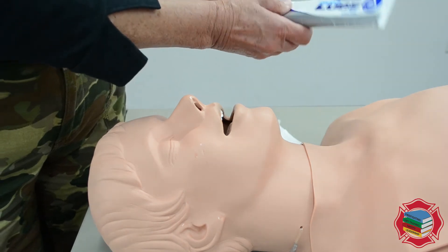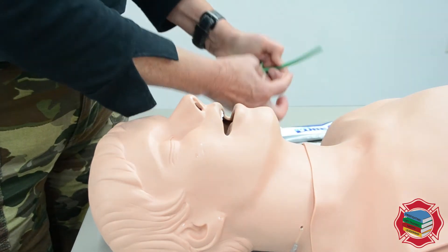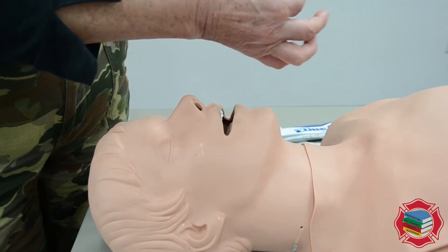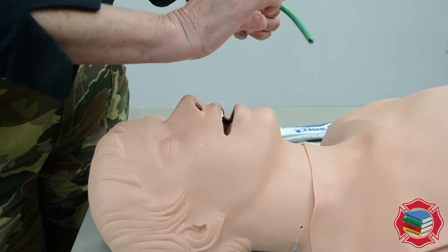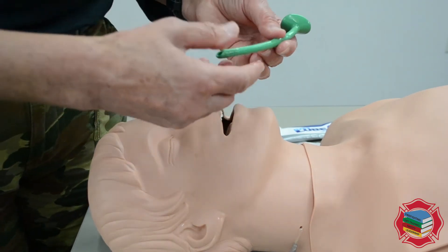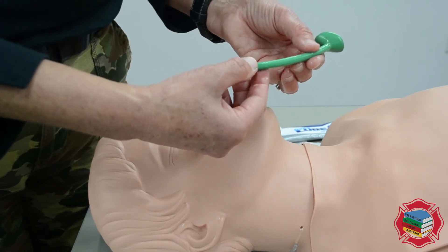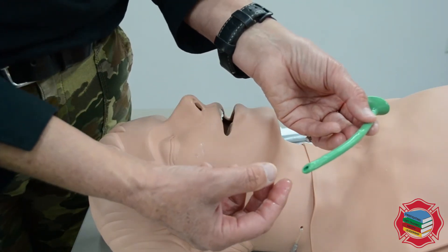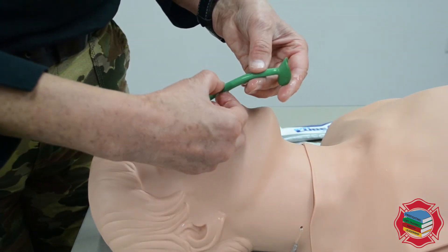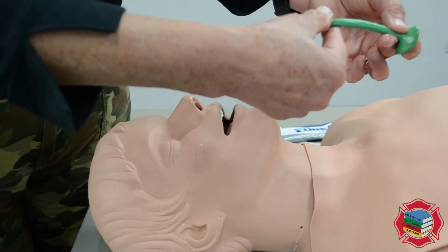I would lubricate it prior to inserting it with a water-soluble lubricant. I'm going to lubricate this airway because it's going into a mucous membrane — it just aids in the ease of insertion. We don't use a petroleum-based product like Vaseline because we're normally using this in conjunction with oxygen, and it can support combustion.